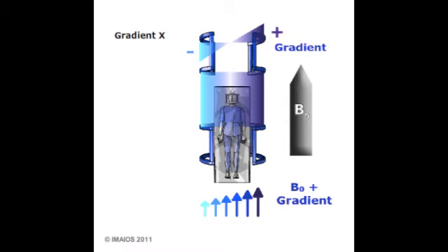The X gradient separates the spin of each proton from your left arm to your right arm. That is going to help you create sagittal slices, because think about it, every proton along that axis from your left arm to your right arm is going to be spinning at a slightly different precession within the bore of the magnet.